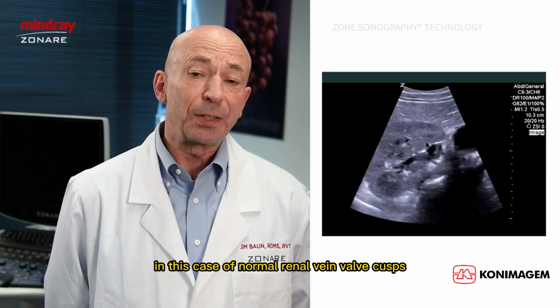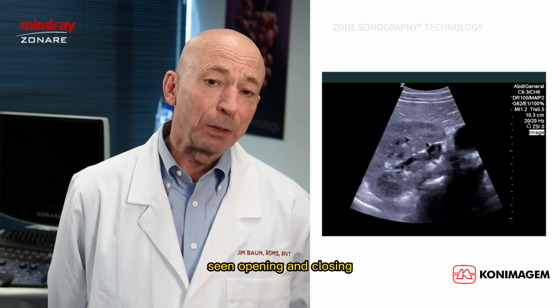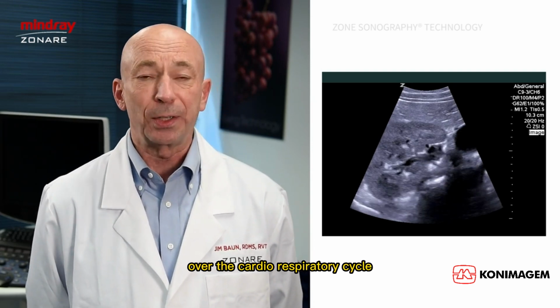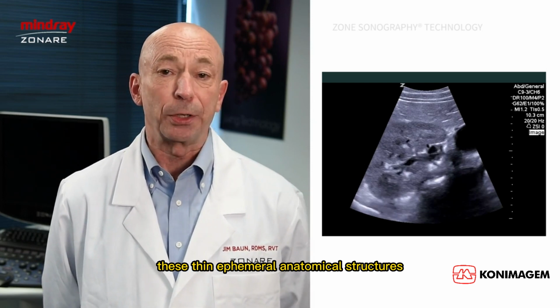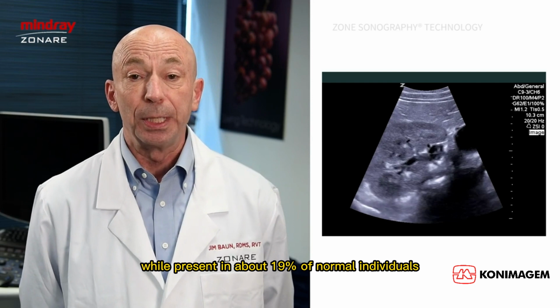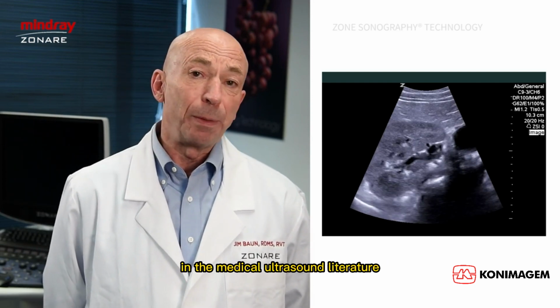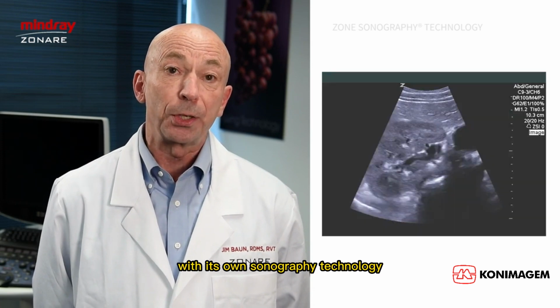For example, in this case of normal renal vein valve cusps, seen opening and closing over the cardiorespiratory cycle. These thin, ephemeral anatomical structures, while present in about 19% of normal individuals, have never been reported before in the medical ultrasound literature prior to their demonstration with zone sonography technology.